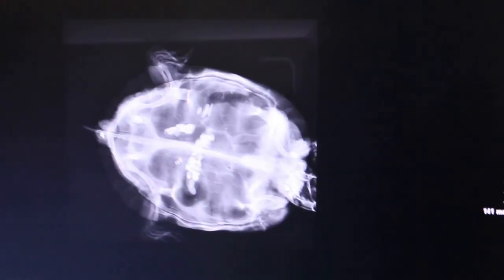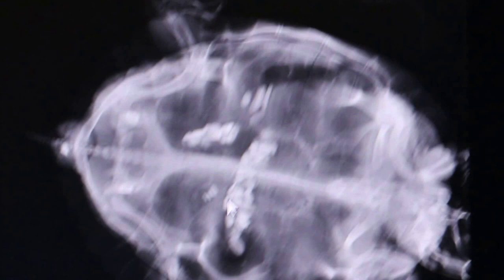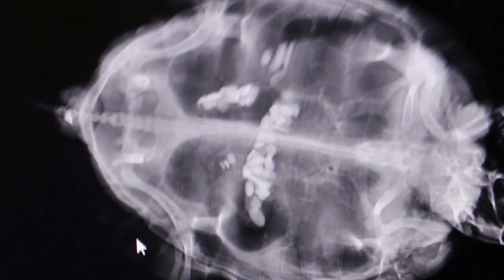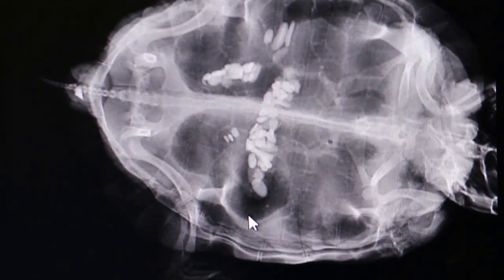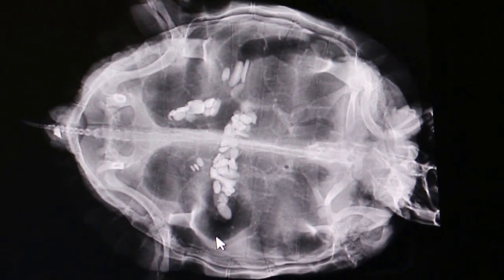There are eggs inside — those are the ovaries, small eggs. No big eggs. The animal has not been eating for the last three days. There was one big egg at the cloaca which we already punctured, sucked out the yolk, and removed three days ago.